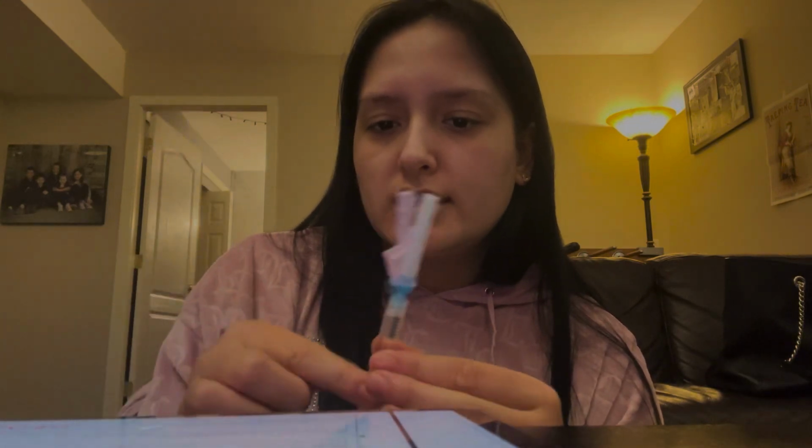There we go. So now that all my medication is in my syringe, I'm gonna place on the needle that I'm actually gonna use to be injecting Natalie today. This is my IM injection needle, and I'm gonna make sure that the safe is on until I'm ready to inject.